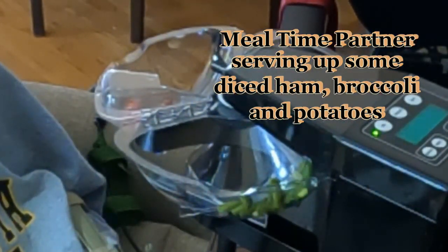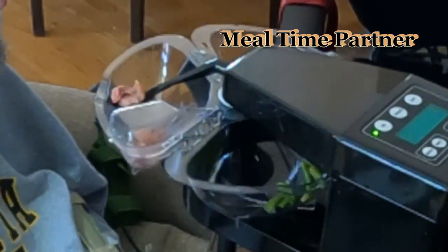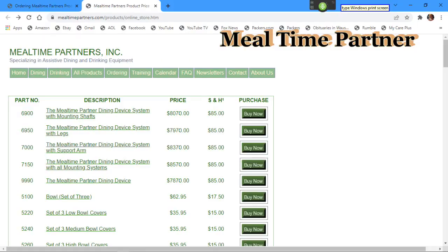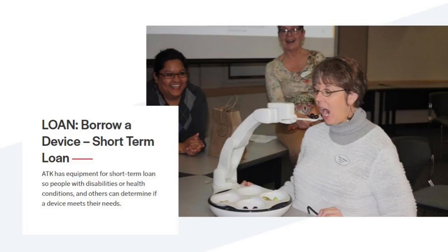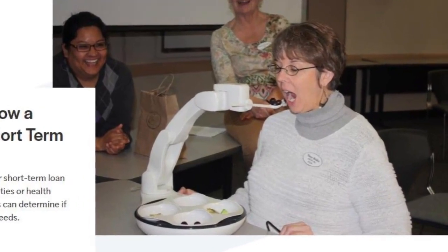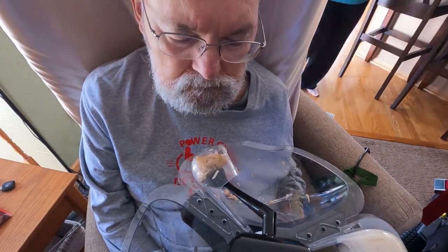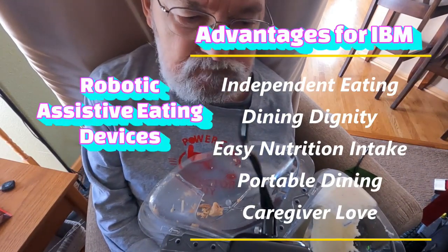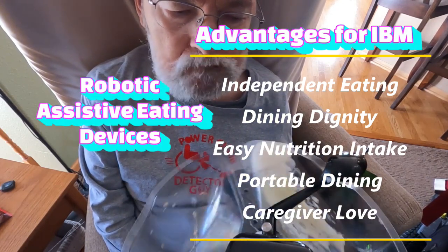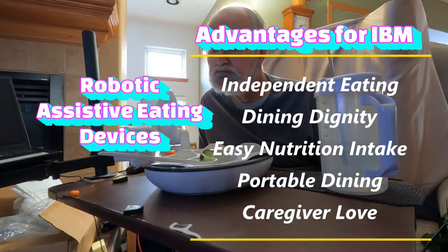Unless you can find some funding to assist you in covering the $6,000 plus costs of these devices, you'd better start saving soon. The Mealtime Partner is a much older technology device and is yet more expensive than the OB unless you can find a used one. Your local Assistive Technology office in your state might be able to assist you with your technical device requirements as your IBM decreases your skeletal muscles. Assistive Technology of Kansas provided me with the Mealtime Partner to use before the availability to try out the OB. I will be talking to the Assistive Technology office about taking the next step in getting this type of technology in the near future to keep my stay-at-home wish alive, hopefully for some additional years.